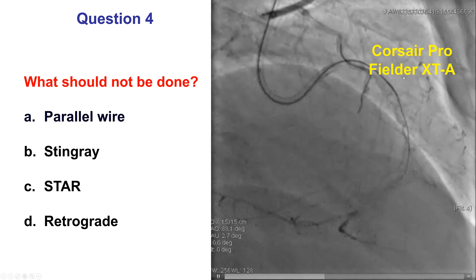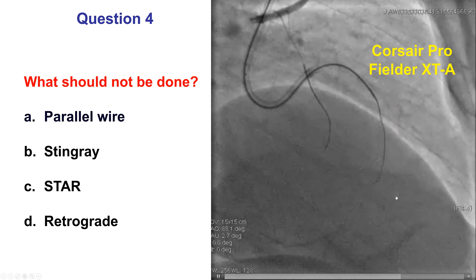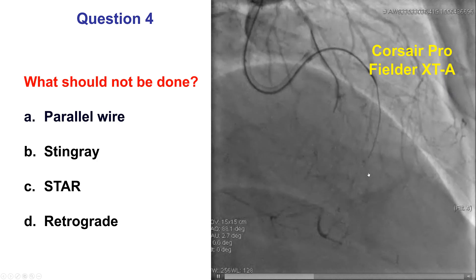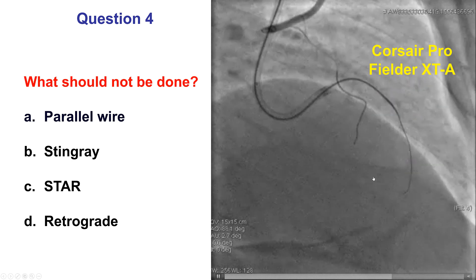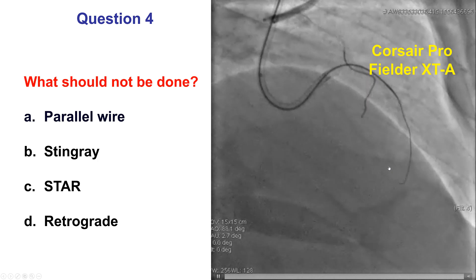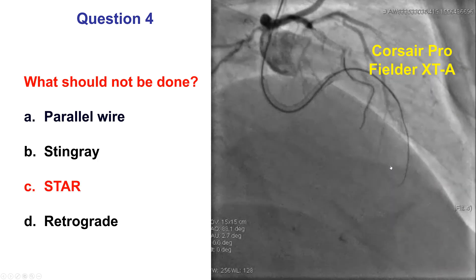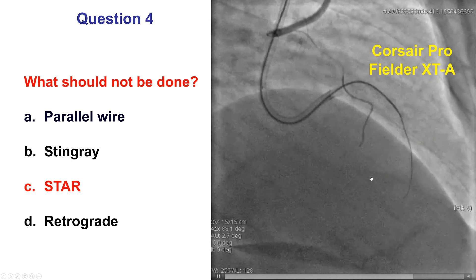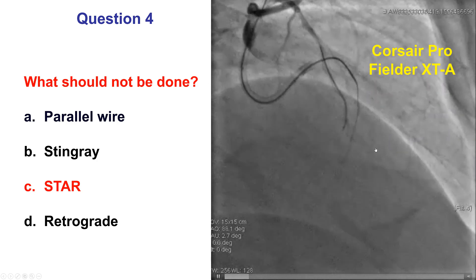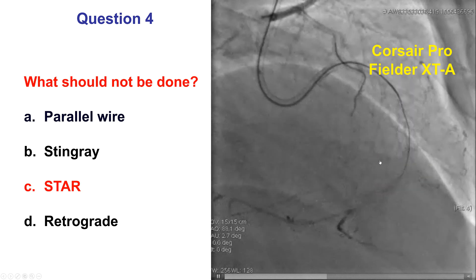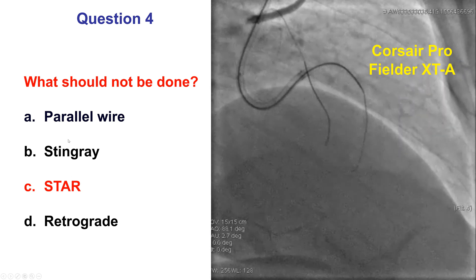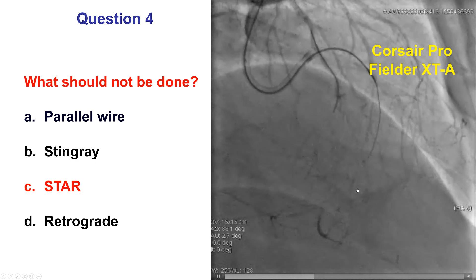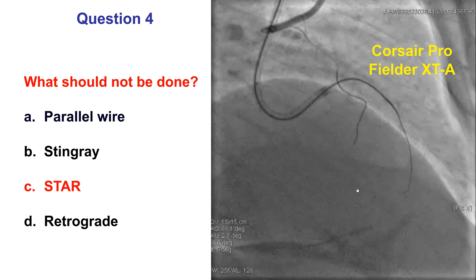We tried with a Corsair and a Fielder XTA, which seemed to advance along the course of the vessel but would not advance any further. On dual injection, it looks like we're still within the body of the CTO. What should not be done in this case is STAR — subintimal tracking and re-entry. The ideal thing would be to either cross with a wire, or if re-entry is needed, do a targeted re-entry with the stingray system or use the parallel wiring technique, rather than enlarging the dissection plane using the STAR technique.